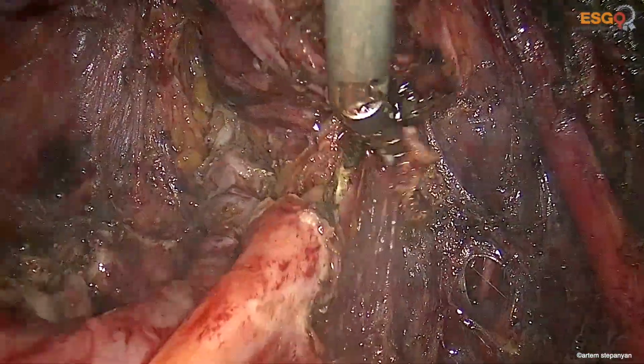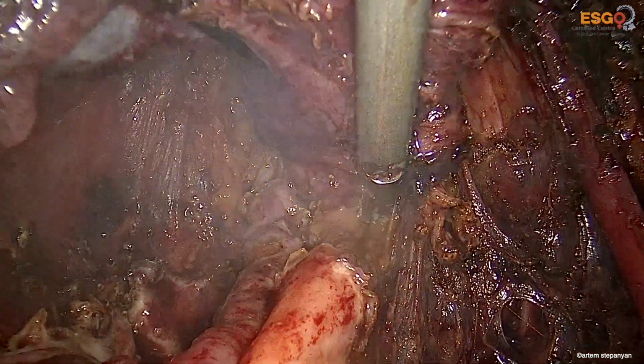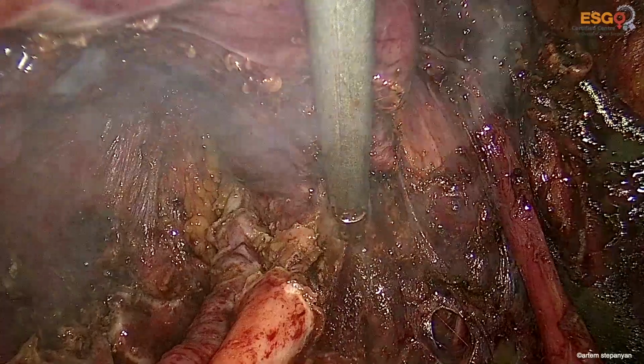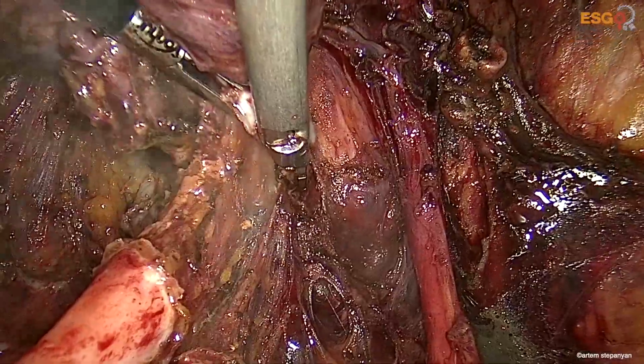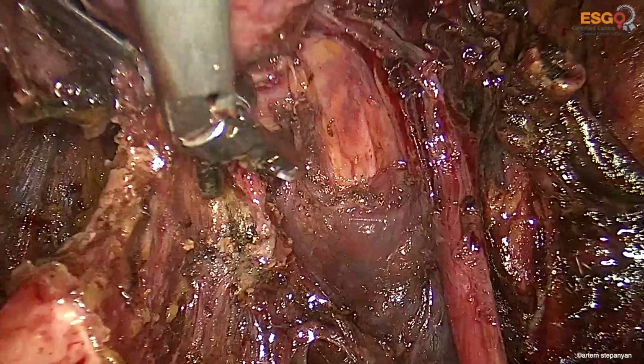Once the right ovarian tumor and the surrounding peritoneum is detached, we will move towards the Douglas's pouch peritoneum and detach it from the anterior rectal wall and the mesorectum.